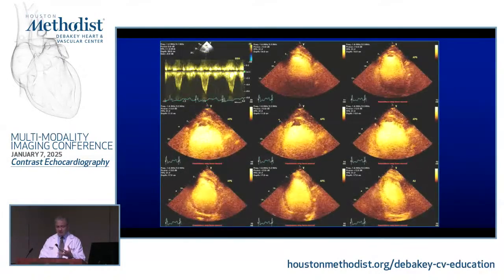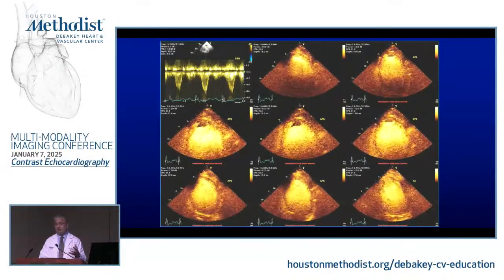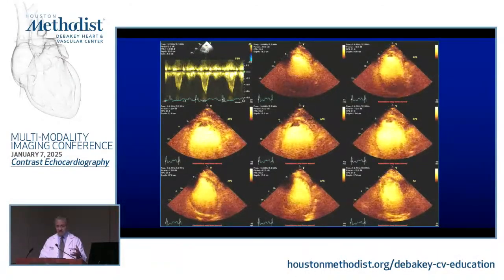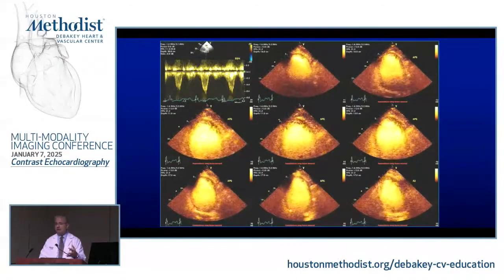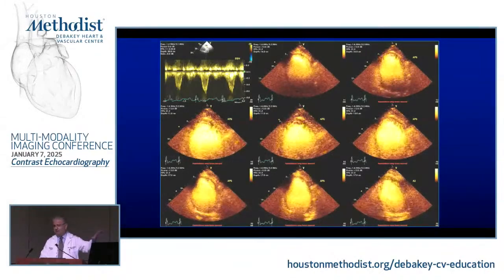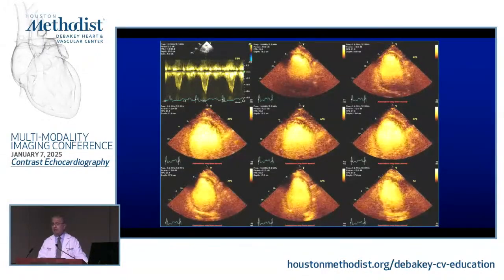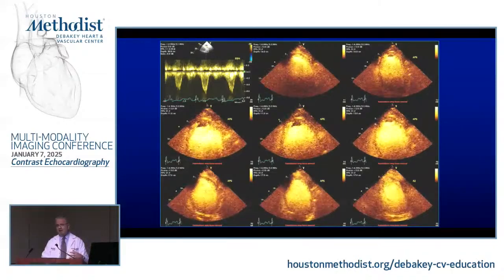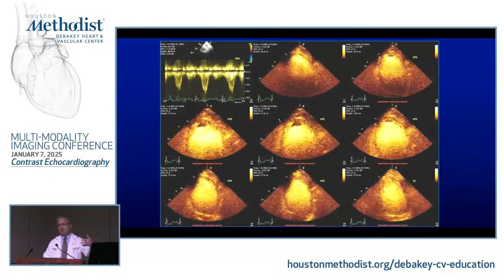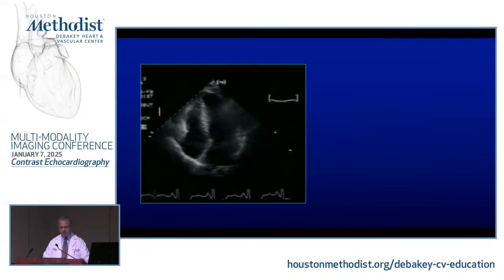So this is the same patient with a contrast, right? So you could not suspect a thrombus in this patient. Management is very different. Prognosis would be very different on a mobile thrombus that you're seeing there in the apex, okay? So yes, ventricular function is down, heart failure, you name it, everything else, but I think it's important to see as much as you can for a better diagnostic accuracy. So don't be shy. If I'm not seeing the apex well, where most of these thrombi would reside, I would use contrast in those situations. I think this is very important.